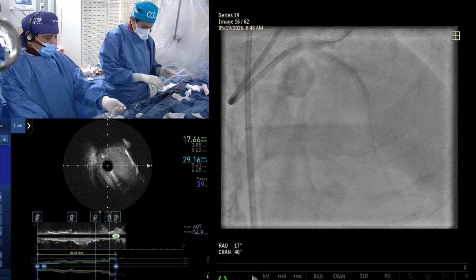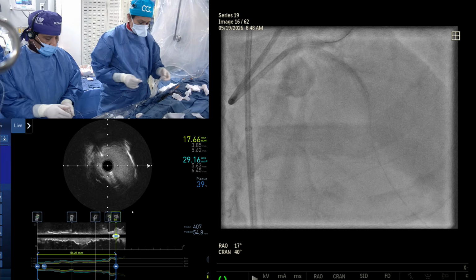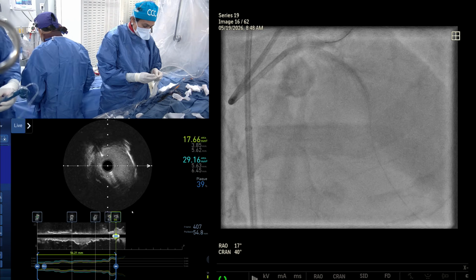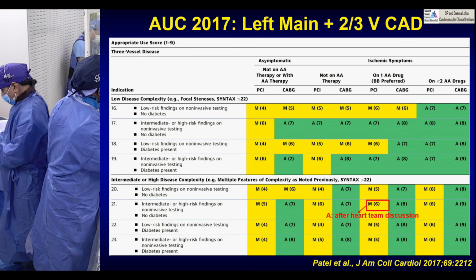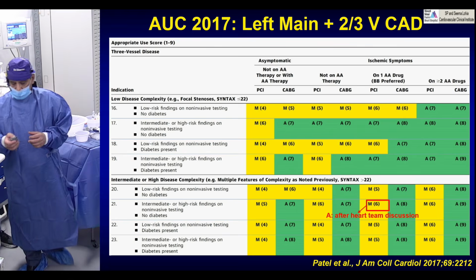All right, let's put this stent in. You took 3.0 by 48? Yeah, 3.0 by 48. Okay, good. All right, so while putting it and proximally optimizing with a 4.0, which one? 4.0 by 15, right? We can open our presentations. Yeah, go with your presentation. We will do the IVUS after, then you will show it. Okay. So this was appropriate.